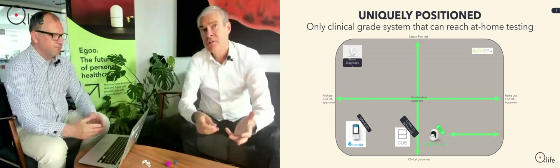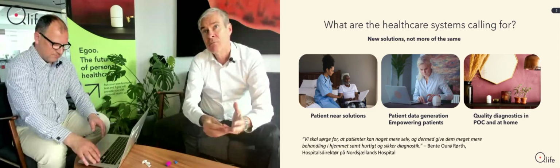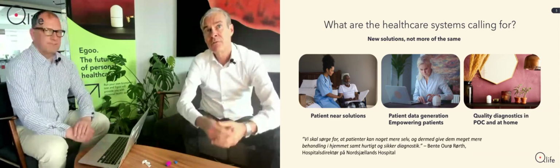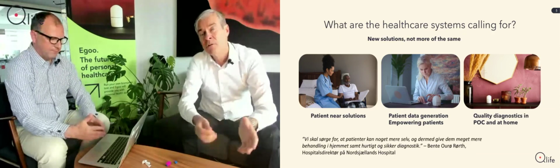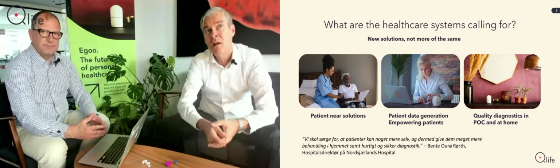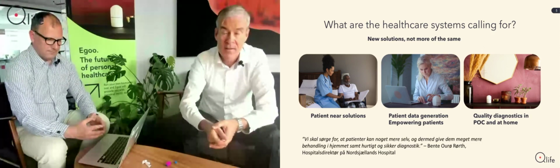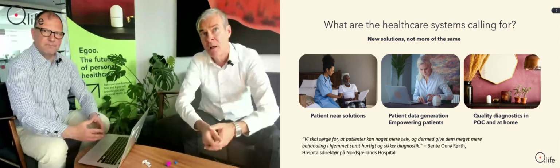Yes. So if you go to the next slide, I can do that. I just change here. This one? Yes, this one. I'm basically indicating here that the 3 big segments that we are interested in relate to mega trends in societies, in the healthcare that we see. The first one is what we call at-home hospitalization. There's a big push towards keeping patients at home from the hospital.